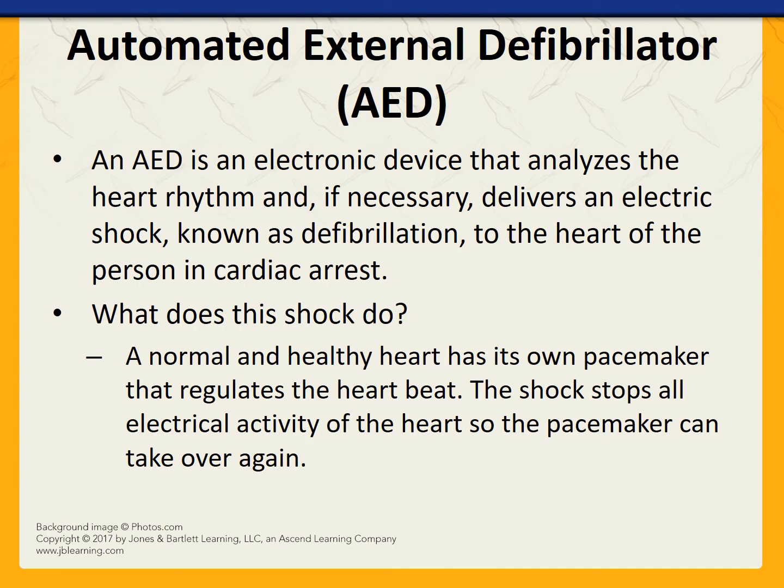Now let's talk about AEDs, also called automated external defibrillators. An AED is an electronic device that analyzes the heart rhythm and, if necessary, delivers an electric shock known as defibrillation to the heart of the person in cardiac arrest. Now you might be thinking, what does this shock do? Well, a normal and healthy heart has its own pacemaker that regulates the heartbeat. The shock provided stops all electrical activity of the heart so the pacemaker can take over again.